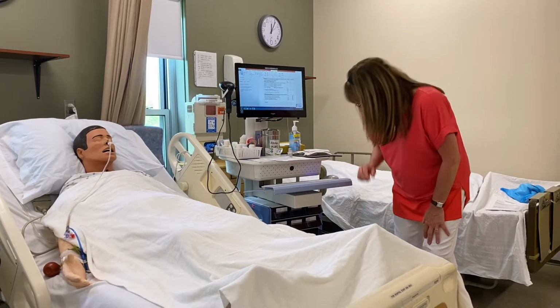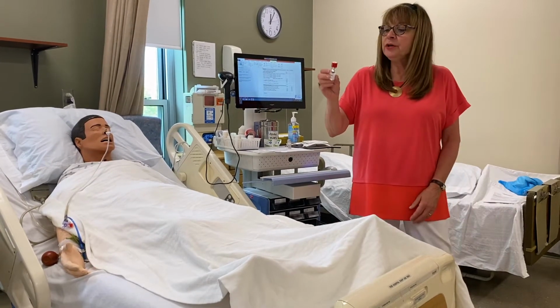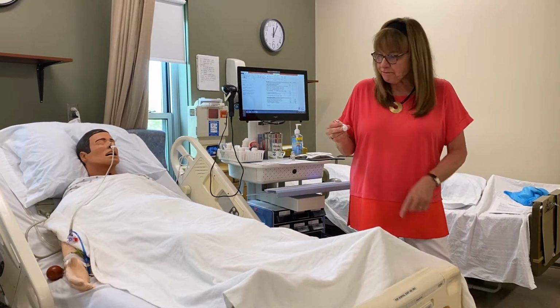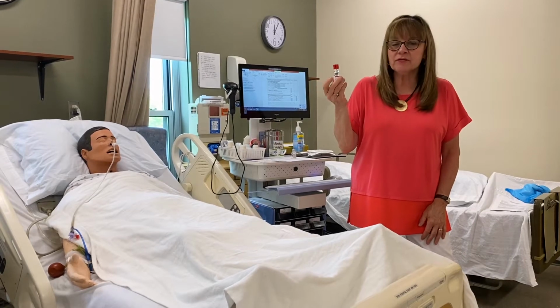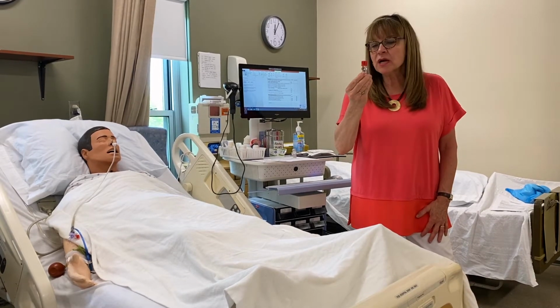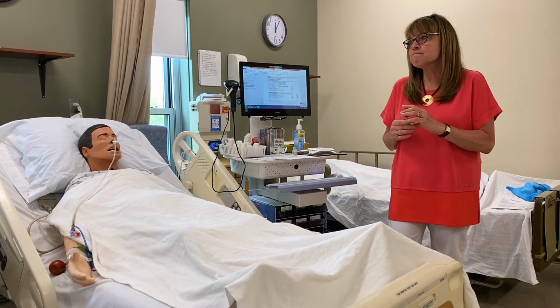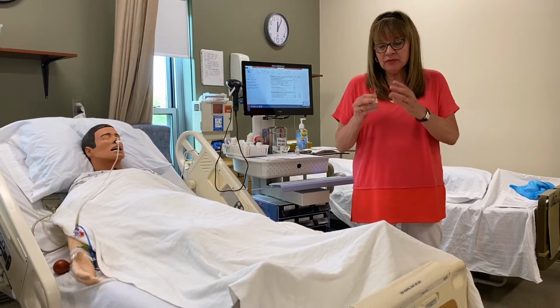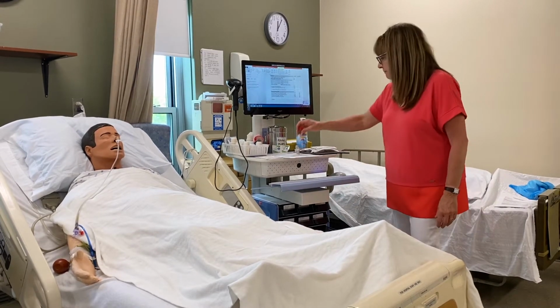Some medications will come in the form of powder, like this vial that has a powder in the bottom and then diluent on the top, and we'll show you how to use this. Remember, some meds are not stable in solution for a long period of time, so we have to mix the powder with the diluent right before we give it.